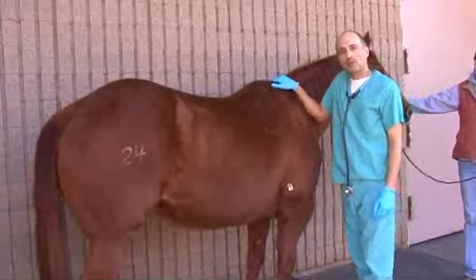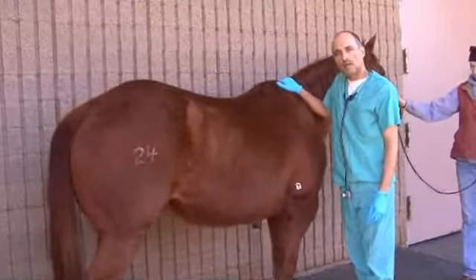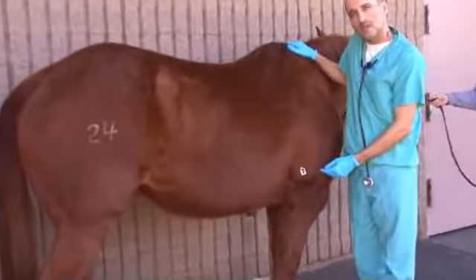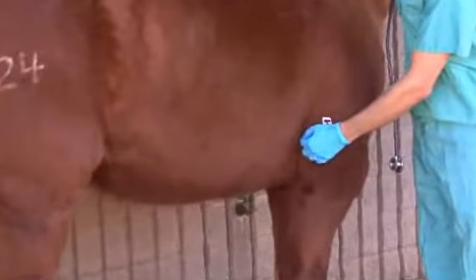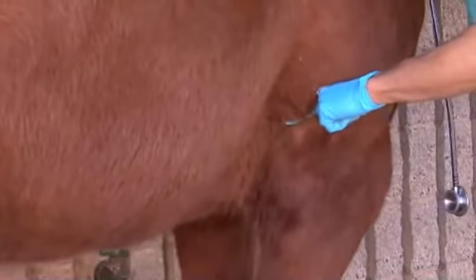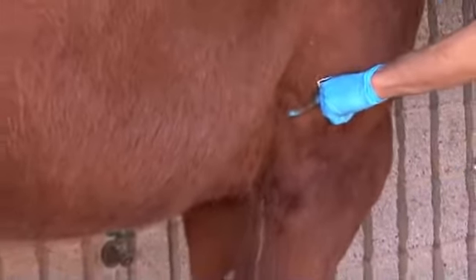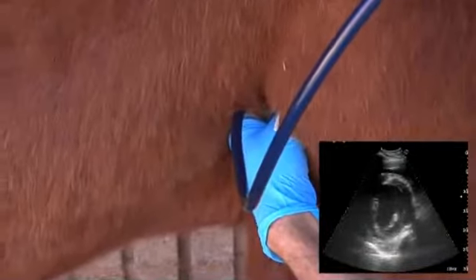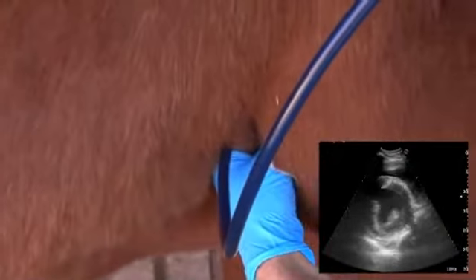On the right side, there's only one valve to listen to, and that's the tricuspid valve. That one is in the 3rd to 4th rib space or intercostal space. So that's very forward. Again, I'm going to have my stethoscope really far forward underneath the triceps musculature. And the level is above the elbow or the olecranon bone and below the point of the shoulder. So it's going to lie in that space really far forward underneath the triceps. Again, what I'm hearing is lub-dub.